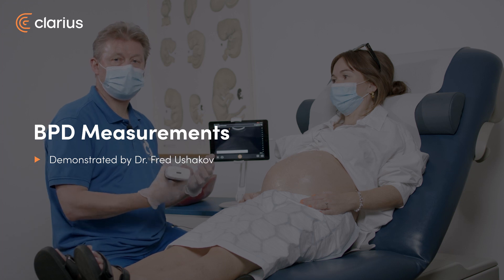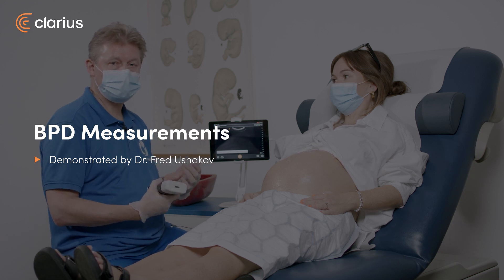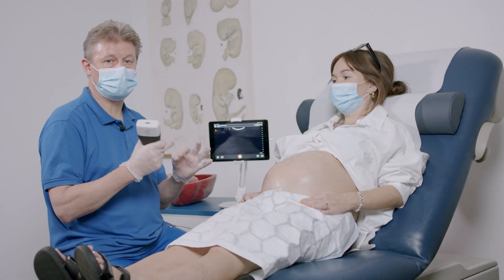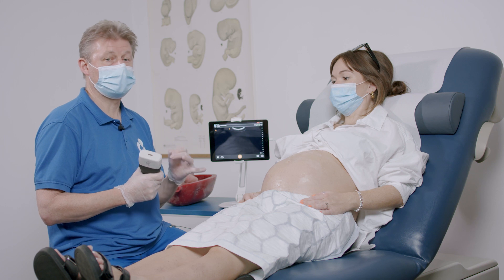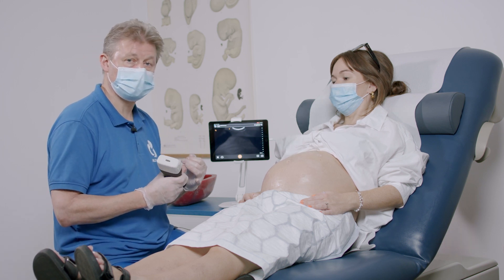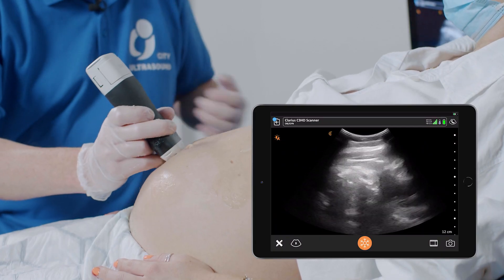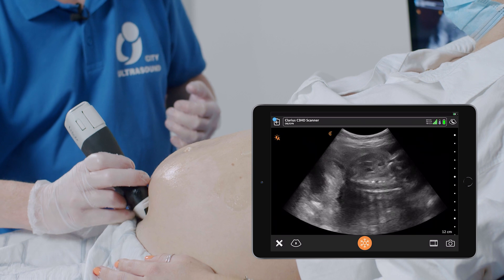I will show how I'm doing measurements of the baby. Routinely we are doing measurement of the head, of the abdomen, and of the femur, and I will show you how it's possible to do this fast and effective. So I'm looking for the position of the baby, and this baby is breech.